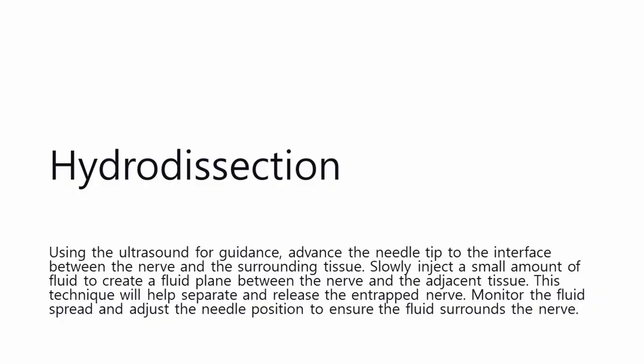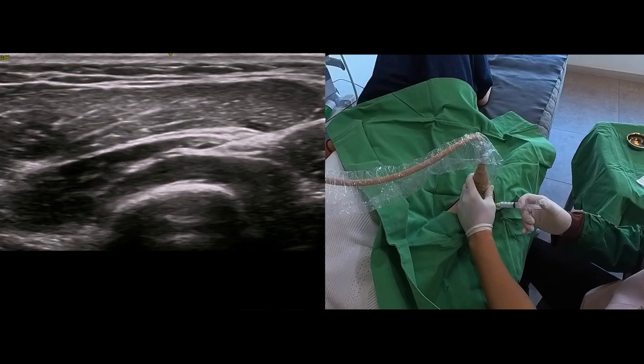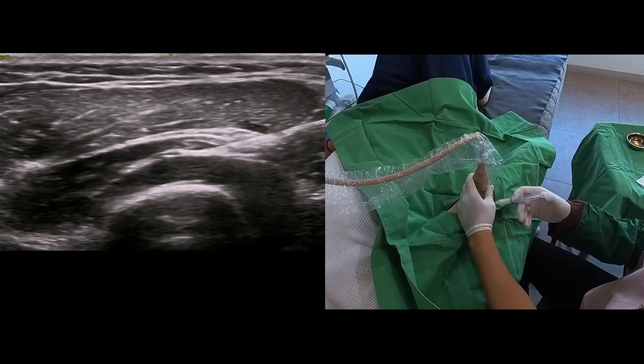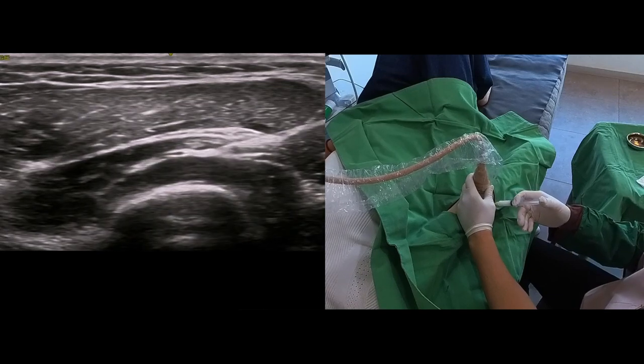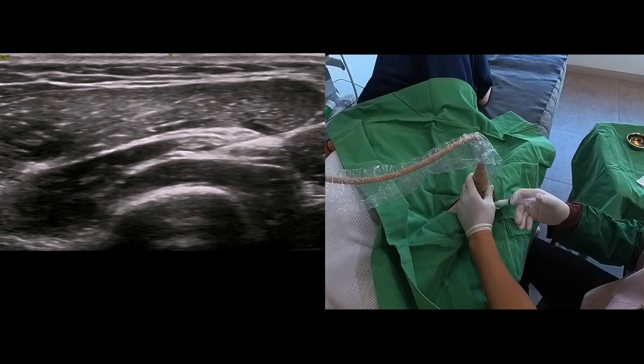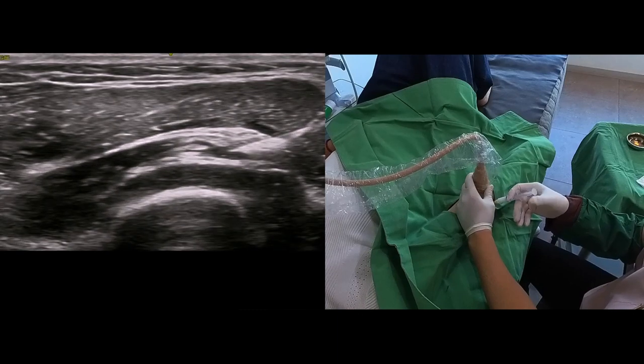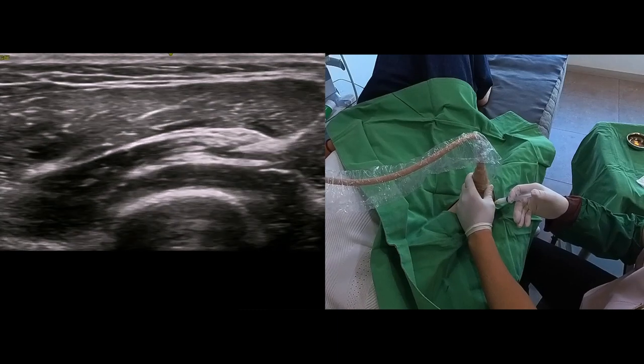Hydrodissection: Using the ultrasound for guidance, advance the needle tip to the interface between the nerve and the surrounding tissue. Slowly inject a small amount of fluid to create a fluid plane between the nerve and the adjacent tissue. This technique will help separate and release the entrapped nerve. Monitor the fluid spread and adjust the needle position to ensure the fluid surrounds the nerve.